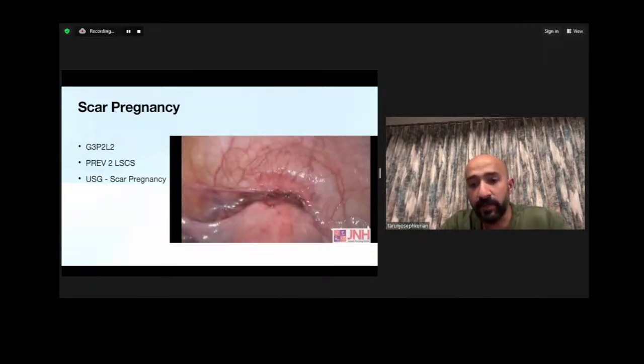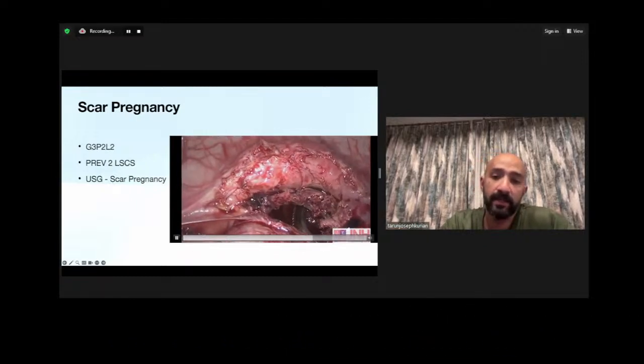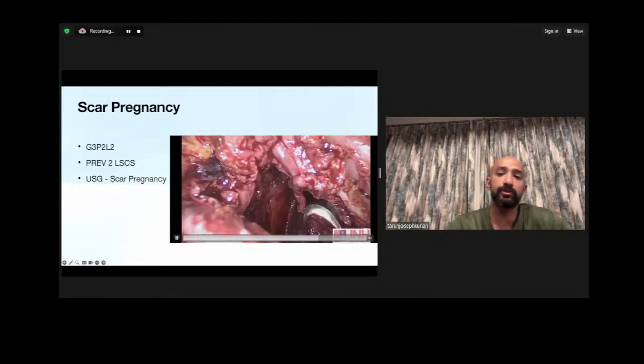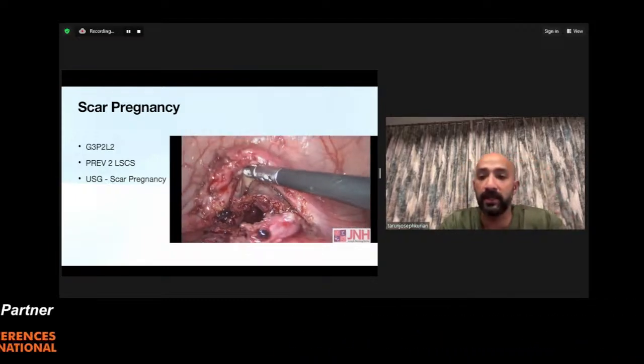Once the entire thing was removed, there you can see the nice cavity. I want you to notice the cervical canal, the cervical layer here is quite thin. Now, this lady was not planning for the pregnancy, so we don't really have to excise too much more. We just had to incorporate that entire thin layer of the myometrium into the suture.